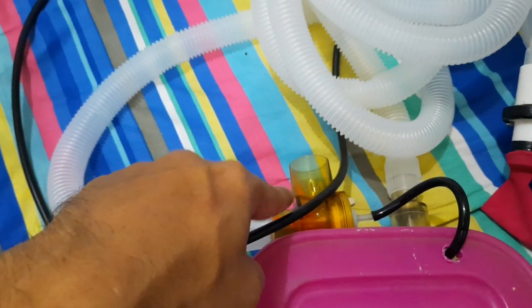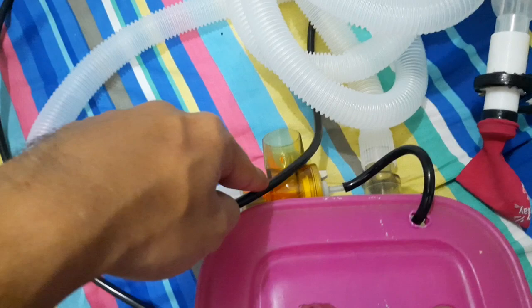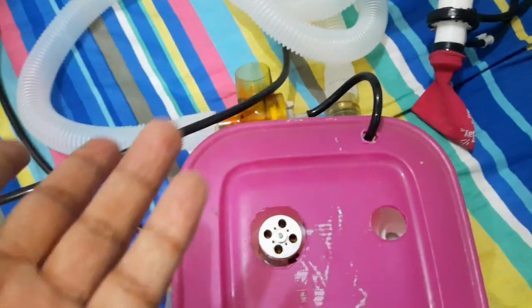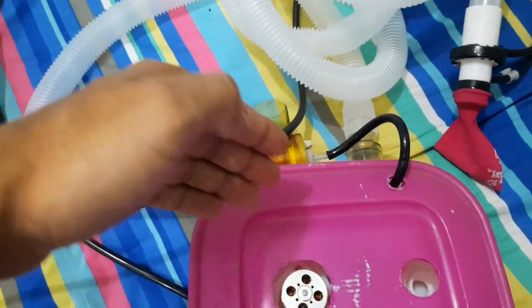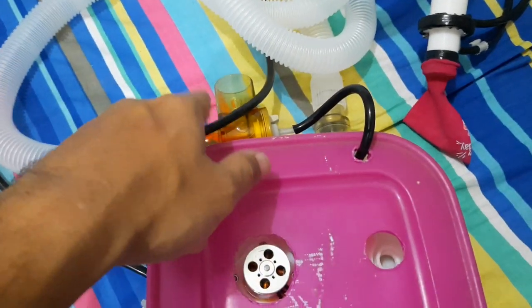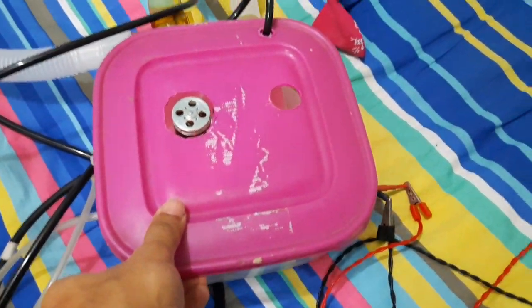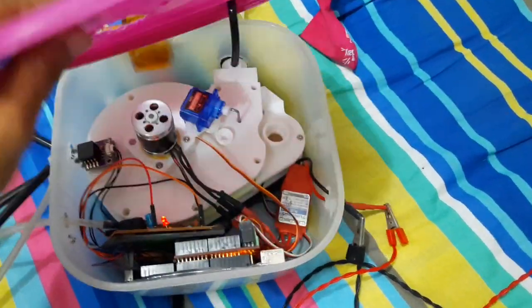This PEEP valve is from another ventilator, but we have actually designed and made a proper PEEP valve. For the time being I'm not using it, because I moved from one hometown to another, so I'm just using this one, but I will release everything in open source. So what is inside? This is very rudimentary and very simple.